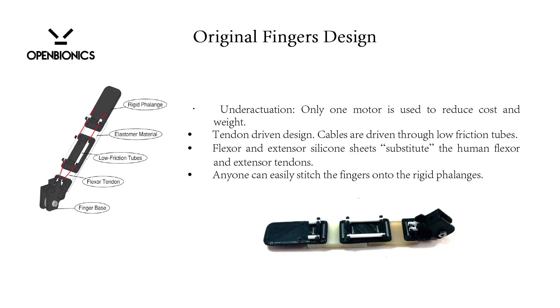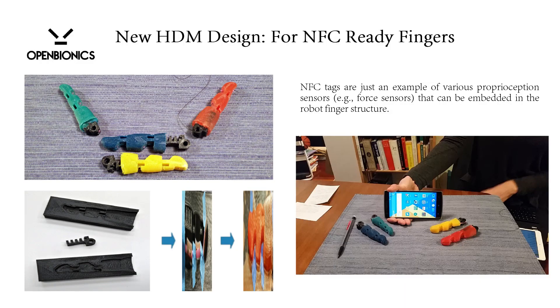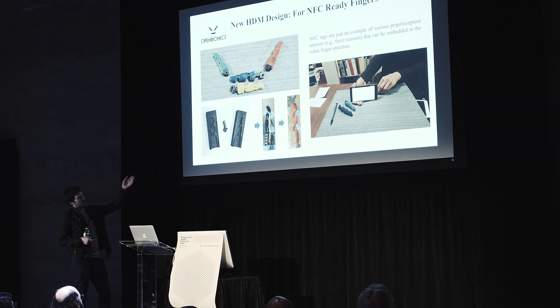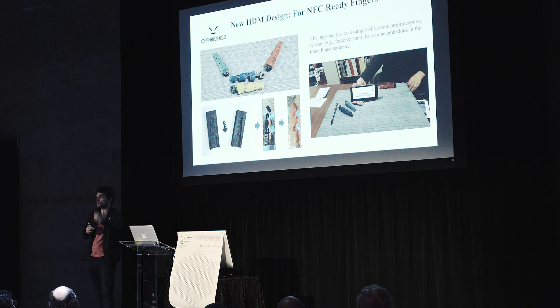The first design had the silicone sleeves stitched onto the rigid phalanges using simple needles. For the second design, we used the hybrid deposition manufacturing technique with silicone casting, and we embedded NFC tags as an example of sensors. When you touch the finger, it opens our website. An amputee with a prosthetic hand can touch their smartphone with it and have different shortcuts for smartphone functionality. You can also embed flex sensors or force sensors to augment the capabilities of the prosthetic device.